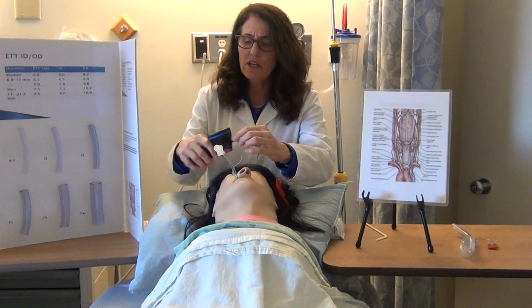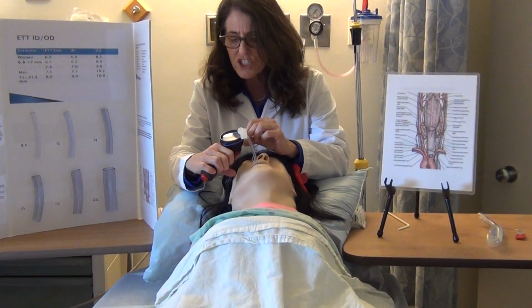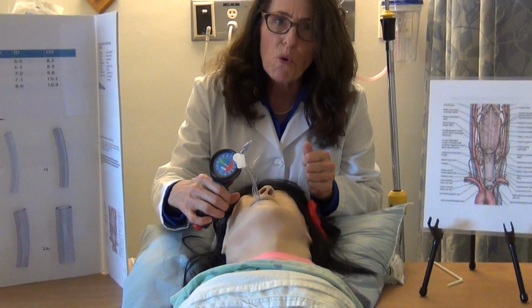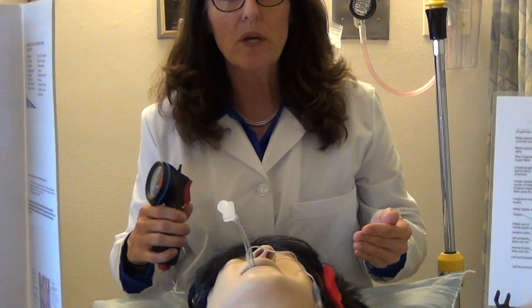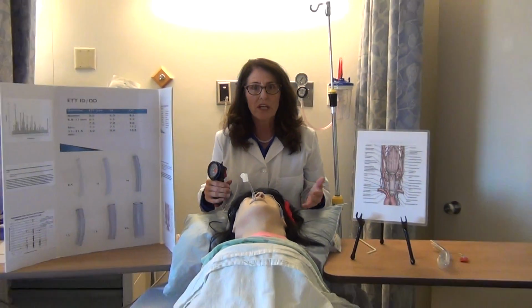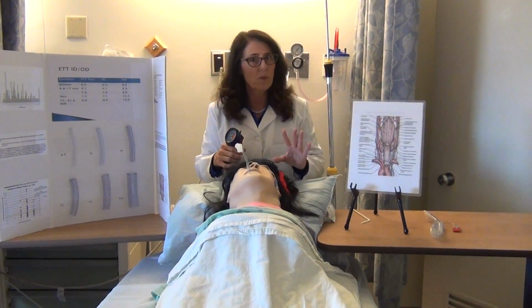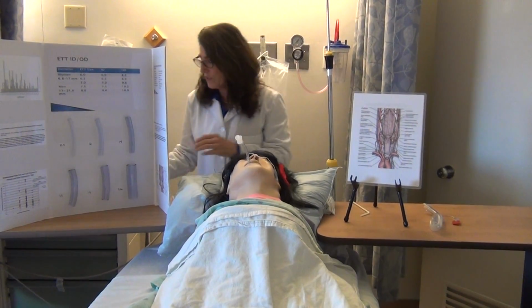So I can see Peggy Sue's pressure is a little bit low, but I can immediately adjust it up between 20 and 30. Why is this important? Less than 20 and I put the patient at risk of aspiration pneumonia. That means liquid can go into her lungs and she could get pneumonia. We don't want that. It has to be greater than 20.